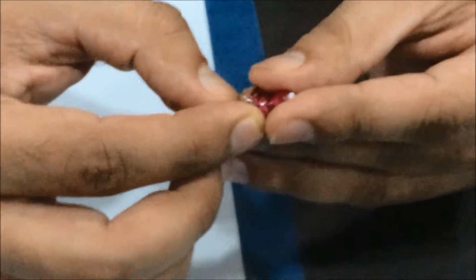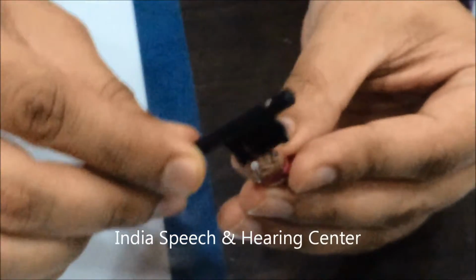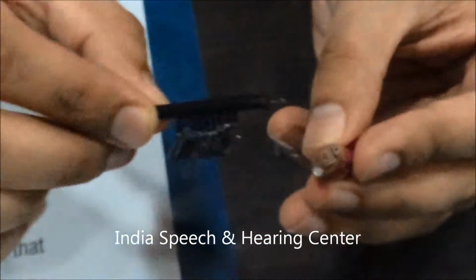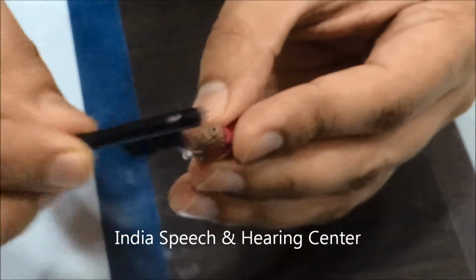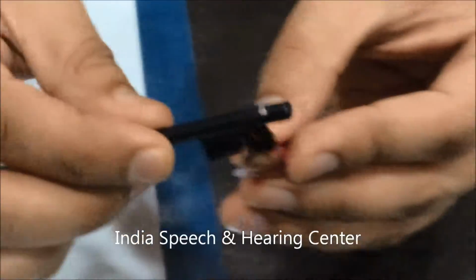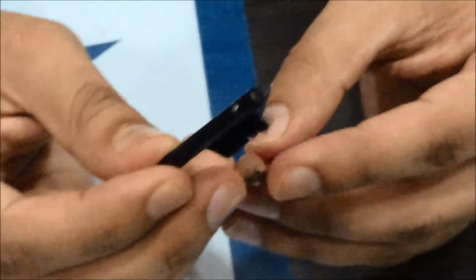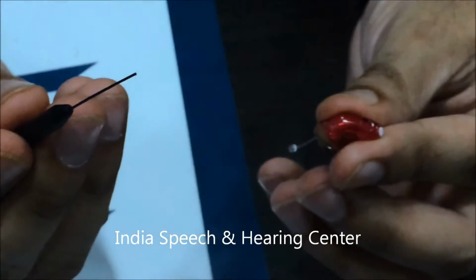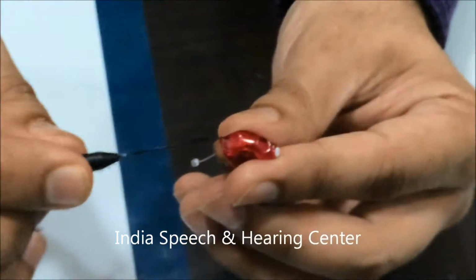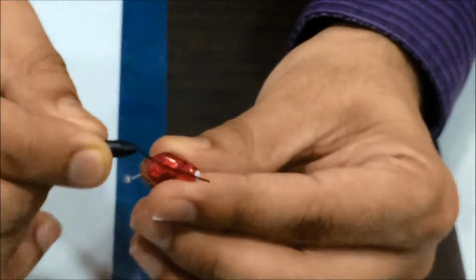The hearing aid also has to be dusted off for any foreign particles using the brush. You can gently wipe the faceplate. This is where the microphone of the hearing aid is. So we have to make sure that there is no dust settling over it. So you can just gently wipe it off every day. Some hearing aids may also have an air vent. You can use the wire or the back end of the brush tool to clean this air vent for any wax deposits.